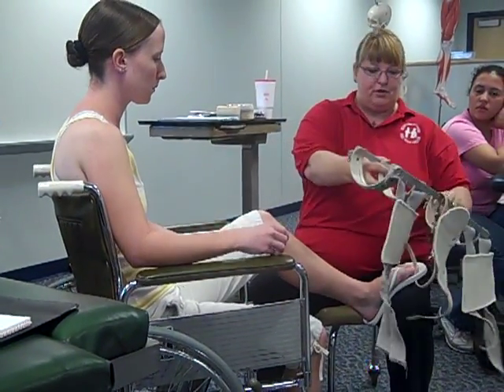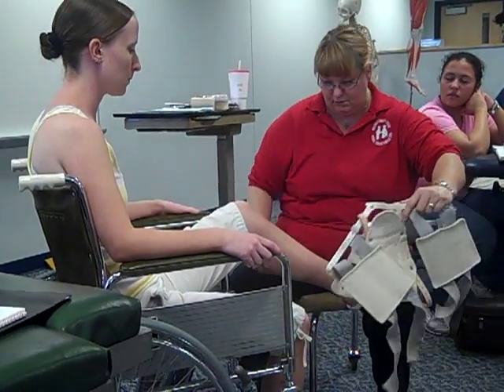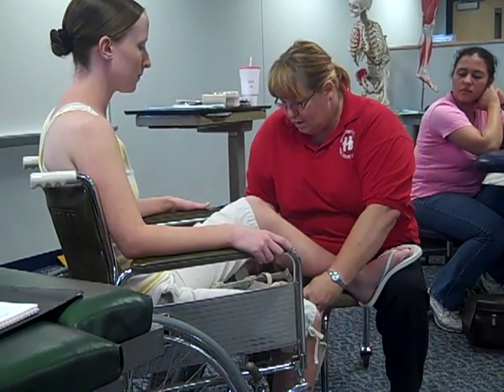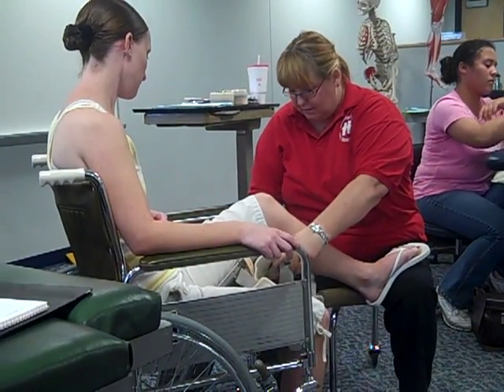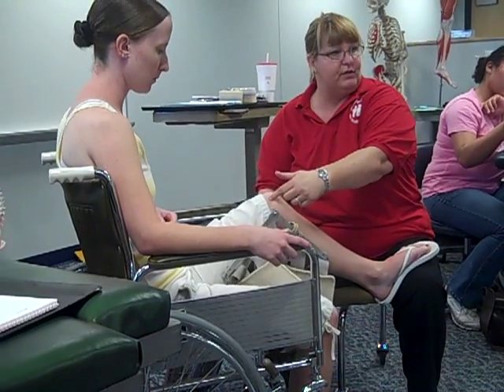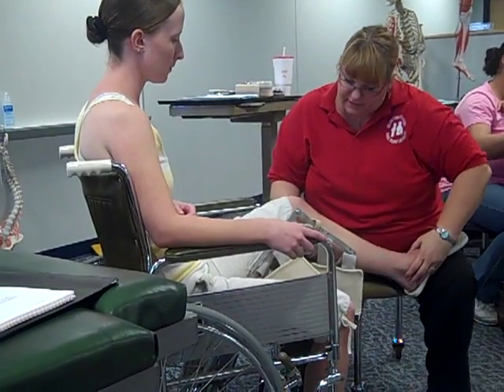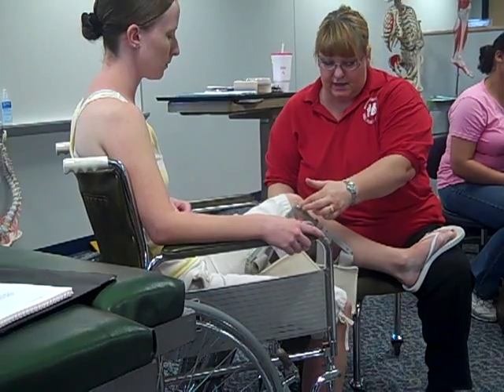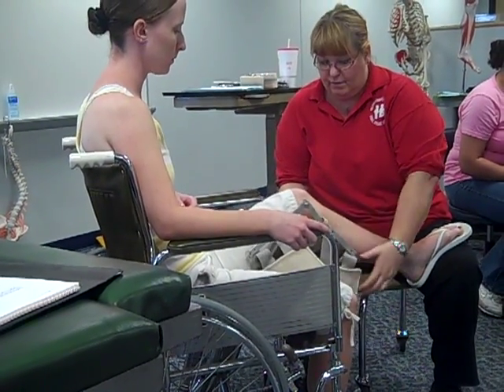We're going to put this underneath your leg to begin with. I'll bend the knee so it'll fit under there easier. The first thing I'm looking at is to make sure that the joint of the knee brace matches up with the joint of her knee. Kind of right in that area looks pretty good. If I straighten and bend her knee a couple of times, I can see that's about the center, and it's lined up pretty well.